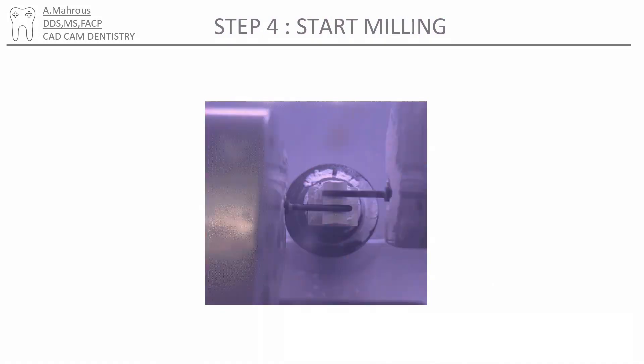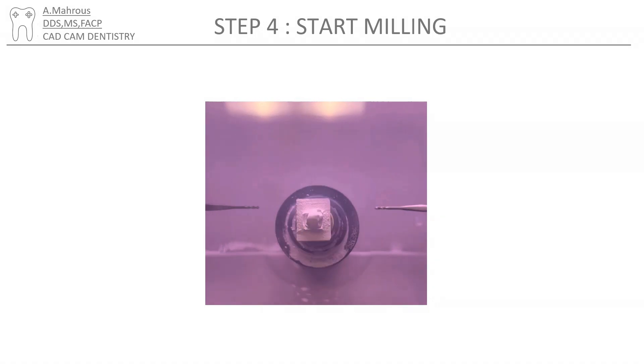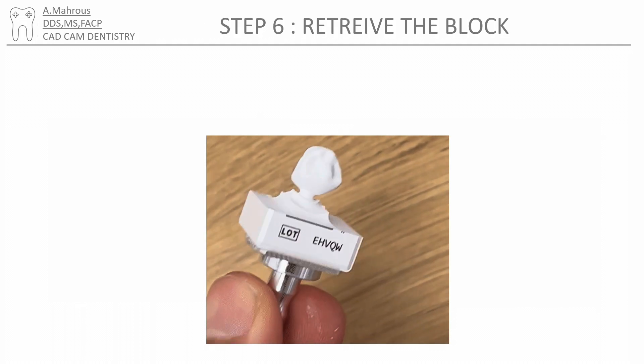Zirconia is drilled under dry milling, so make sure this is a dry mill you're using. The time it takes will vary based on your selection between fast, extra fast, and fine. During that time, it's recommended to grab the block of burrs you'll be using — it looks like this. Eventually the crown will come out and would look like that.